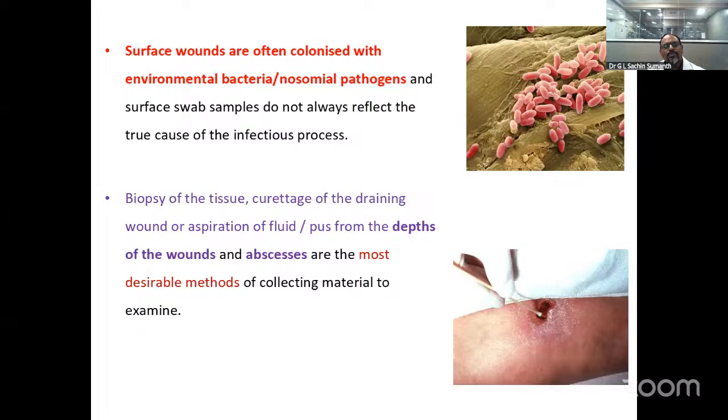And biopsy of the tissue, curettage of the draining wound, or aspiration of fluid or pus from the depths of the wound, that is very important. And abscesses are the most desirable methods for collecting the material to examine.